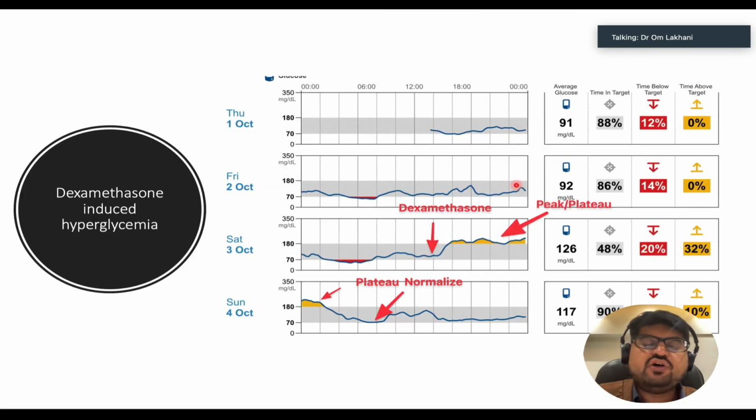I'll tell you what we found. We analyzed our own data. As soon as I saw this, I asked my diabetes educator, who is an assistant to me, why don't you pull out the file of that patient who takes weekly dexamethasone for chemo. We put a CGM once for her, and look at what happened, right? So this is non-chemo day, chemo day. The patient is on a chemo day, the patient received dexamethasone.